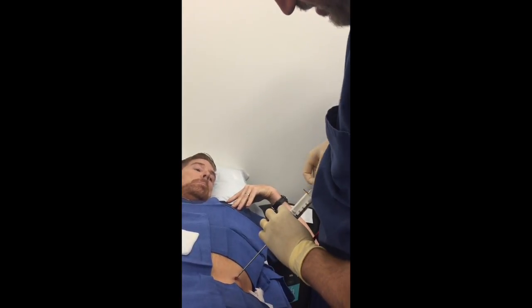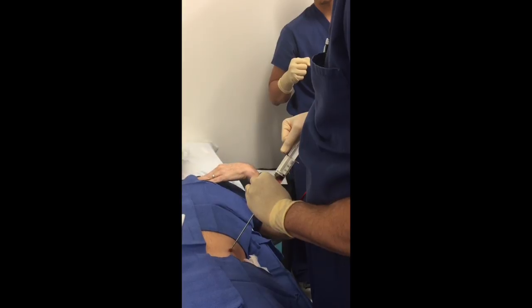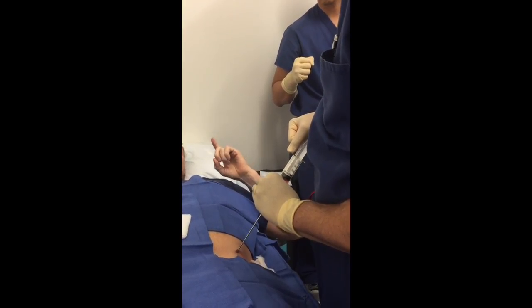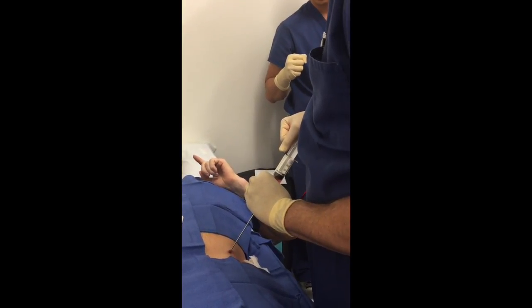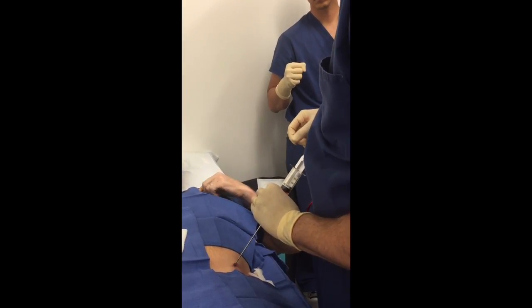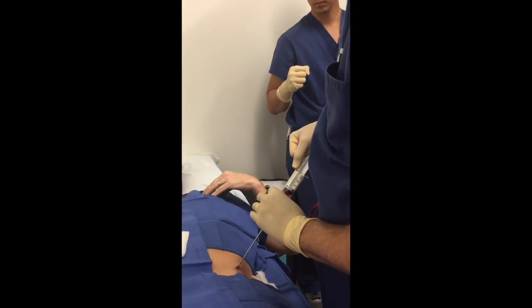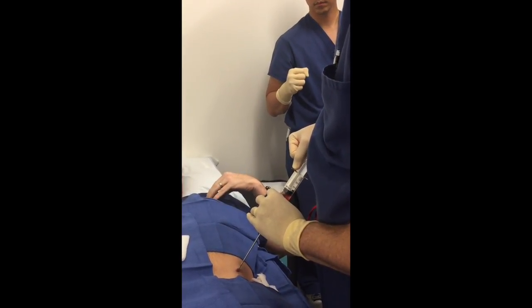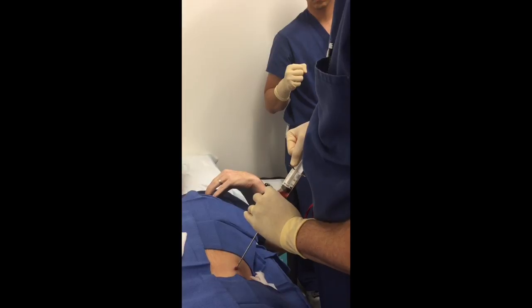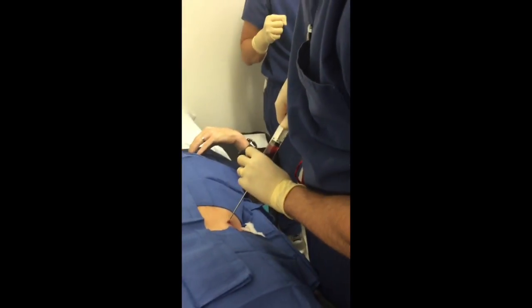That thing was not a bad idea. So when I'm aspirating, can you feel anything? No. What I feel is that slight kind of joysticking of your hand movement. Just to clarify, I feel it but it's not a painful situation. It's just I feel movement. What if I spin it, do you feel? Nothing.